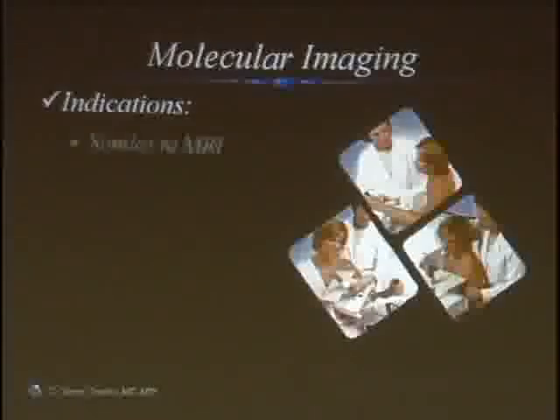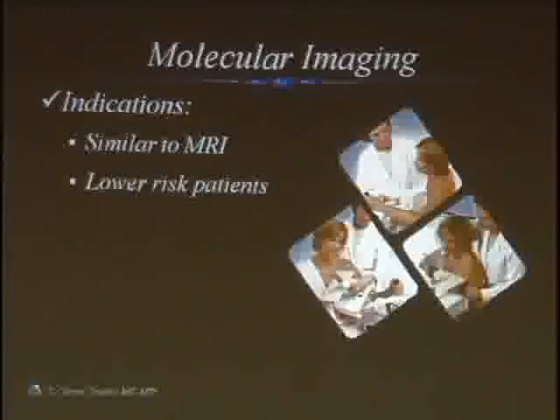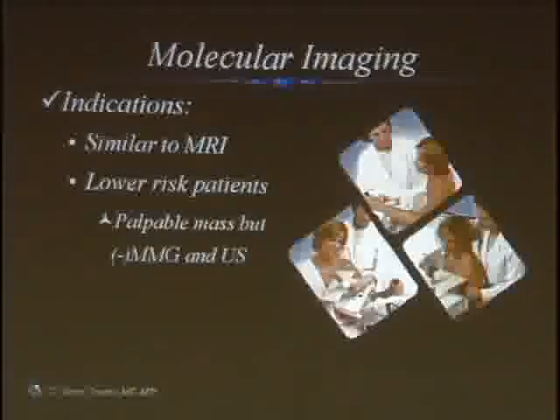Now, what are the indications for it? The indications for this are very similar to MRI. They're very similar to MRI. But it's in low-risk patients, whereas MRI is reserved for high-risk patients, and we'll talk about that later too.